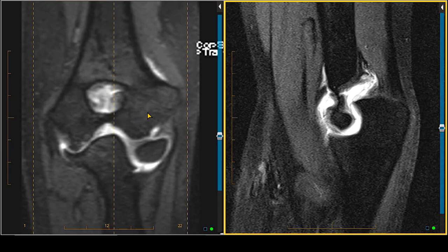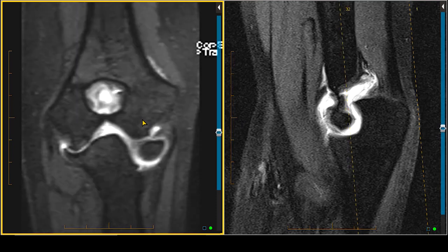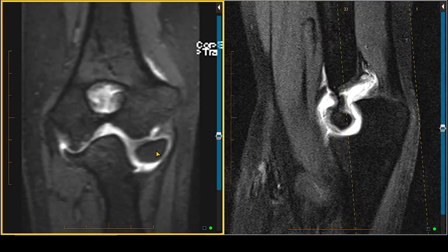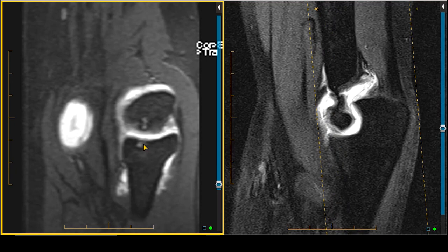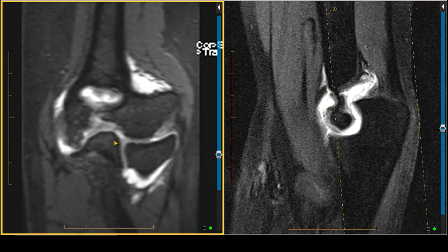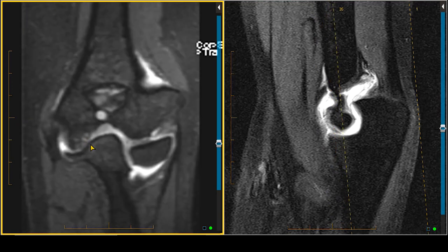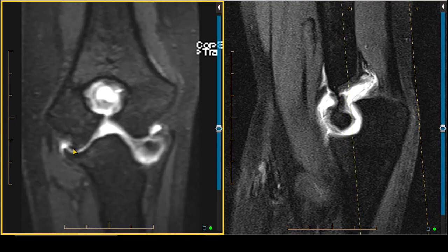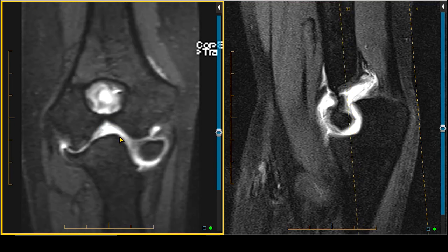It healed up, but then a few years later they started having pain. When we re-imaged them — this is an arthrogram, a T1-weighted sequence with intra-articular contrast, and this is a fat-sat sequence with fluid over here — we saw this big divot and osteochondral lesions involving the radius, the capitellum, and parts of the trochlea. Multifocal areas of osteochondral lesion, cystic changes, degeneration, and even some osteophyte formation — all sequela of long-term abnormality in the joint due to incongruity and avascular necrosis of the lateral trochlea.